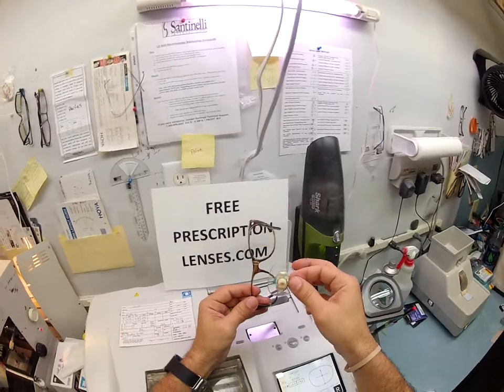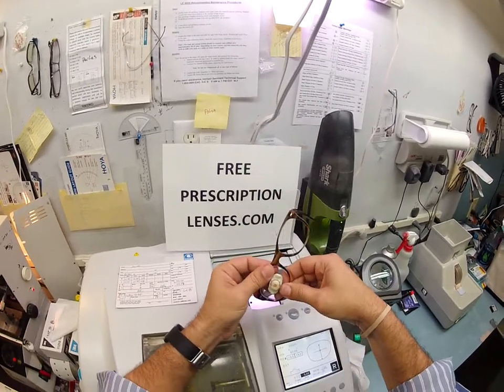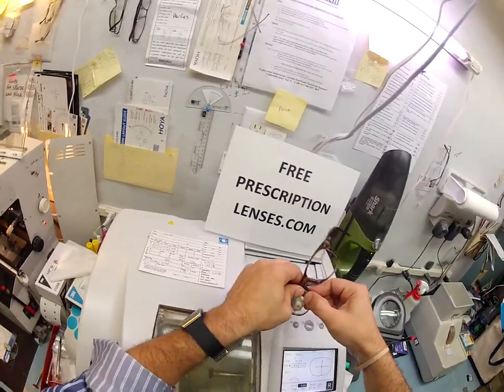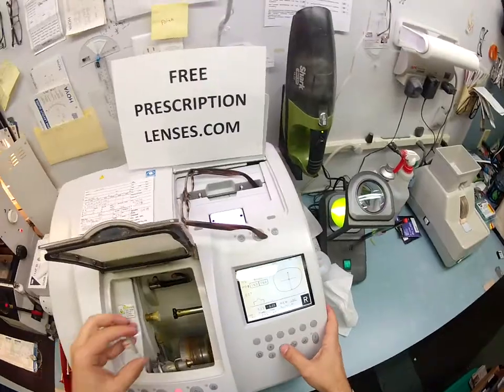So, all right, to make sure this fits, I tuck it in at the outside corner, and then using my thumbs, this one's still alive, I press down at the nose. It's still a little rigid, it doesn't want to give, so I'm going to take it down 1/10 of a millimeter.